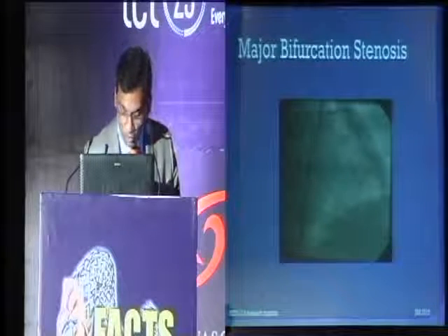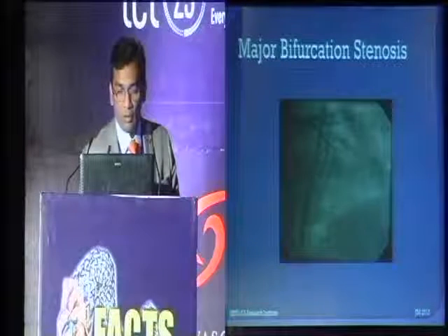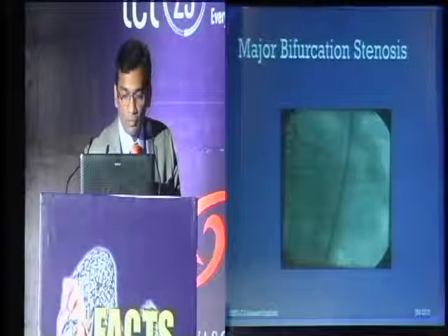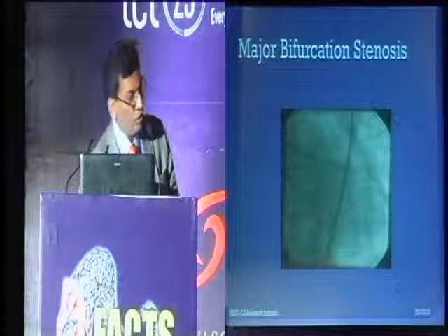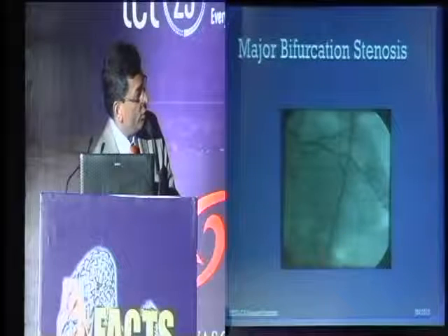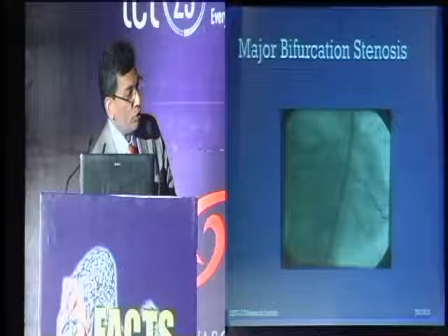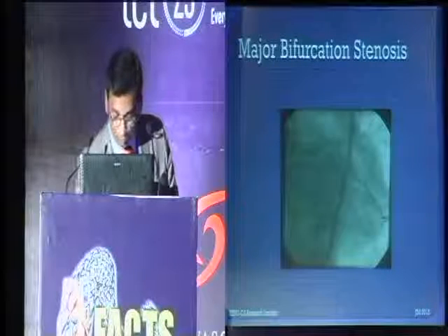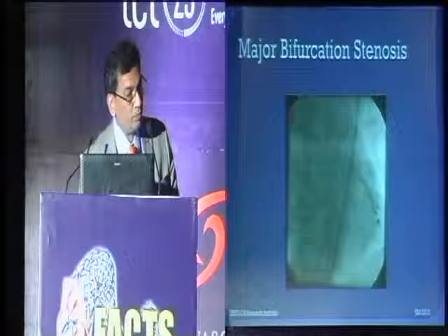We double wired the lesion. After pre-dilating, we used the Silverhawk directional atherectomy catheter. As you can see, I went after the side branch first because that's the straighter of the two lesions, of the two vessels, and also it's bigger of the two. That's after the first pass.